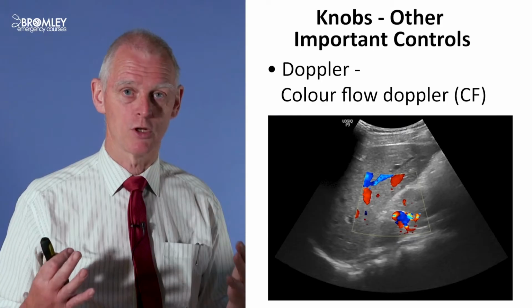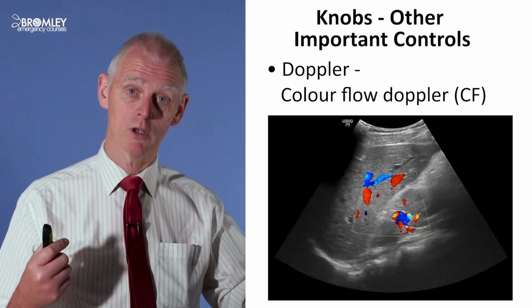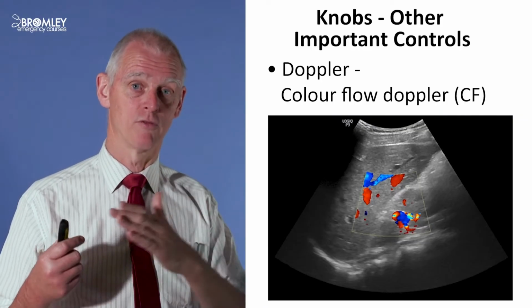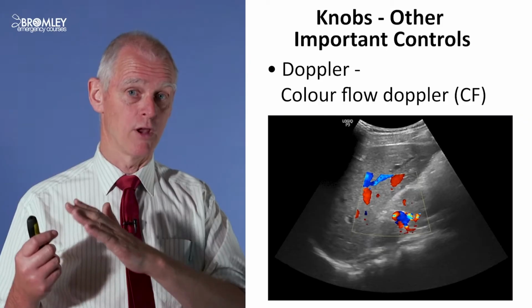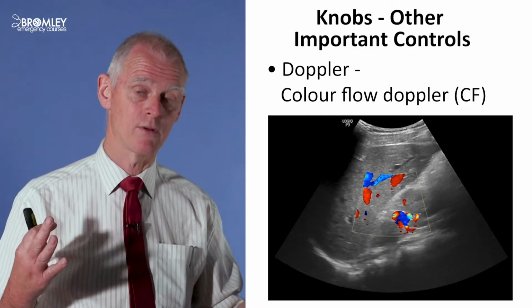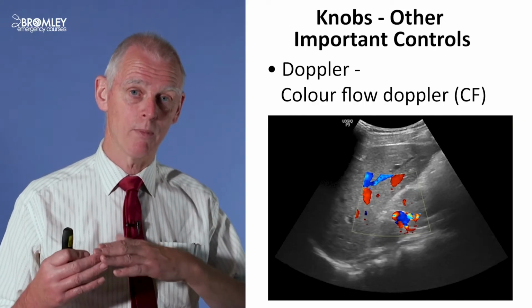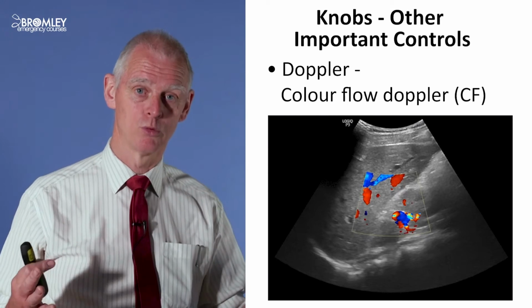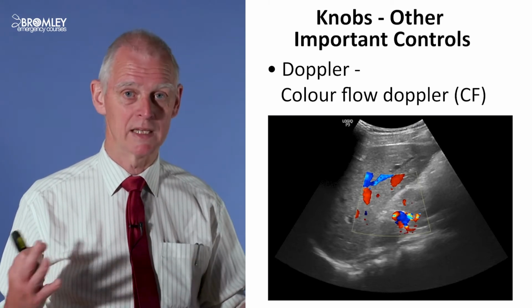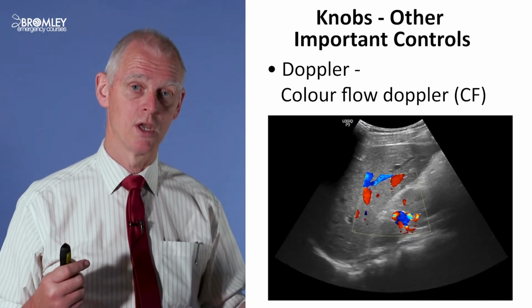And there are many other Doppler functions. For example, rather than colour or sound, it could be numerical with a higher number for a higher flow rate. And from that, we can then get the flow rate in chambers of the heart and integrate it and get volumes and work out details to do with the dynamic function of the heart. So Doppler's a very powerful set of tools within ultrasound, which give ultrasound a great deal of usability with fluid flow. Now, we're not going to use a lot of it in the course, but we are going to use a little bit.